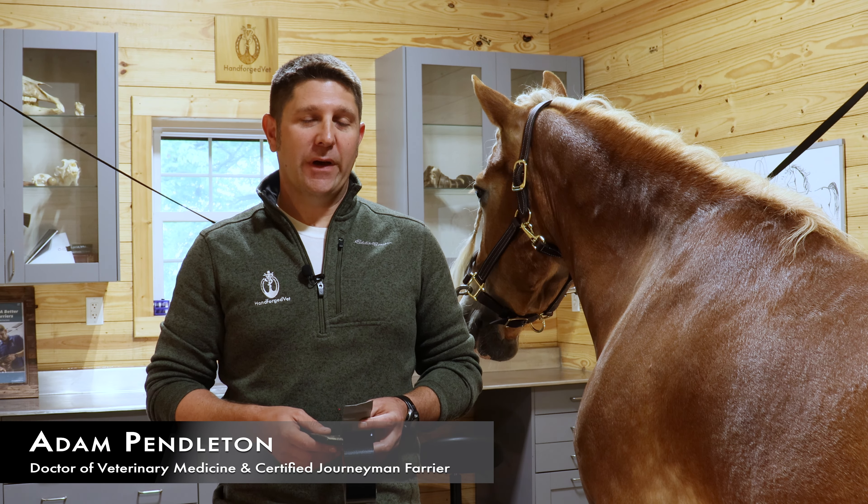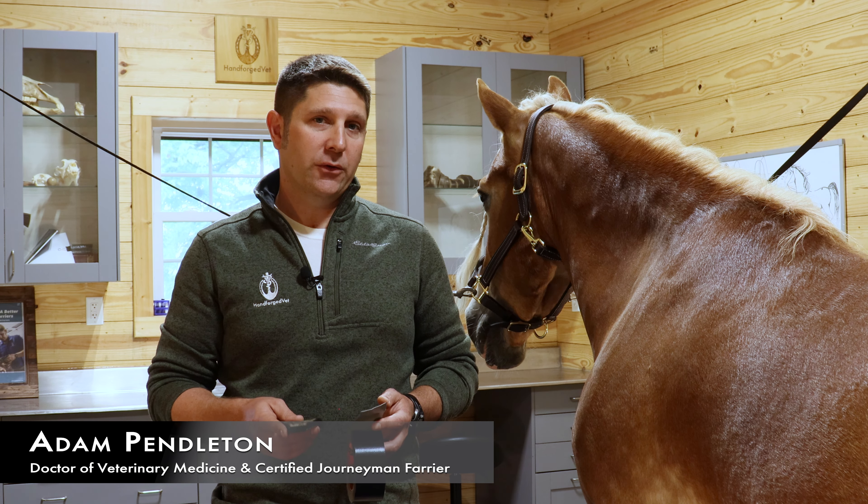Dr. Adam Pendleton here from Hand Forge Vet. I'm going to show you how to put a frog pad on your horse's foot.